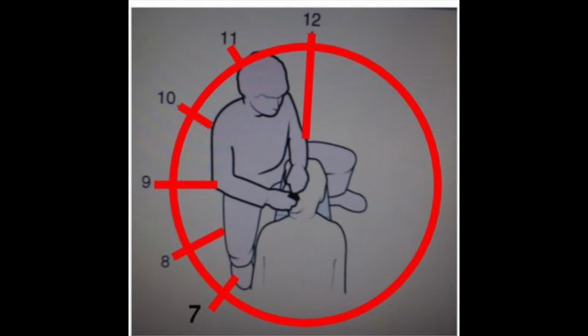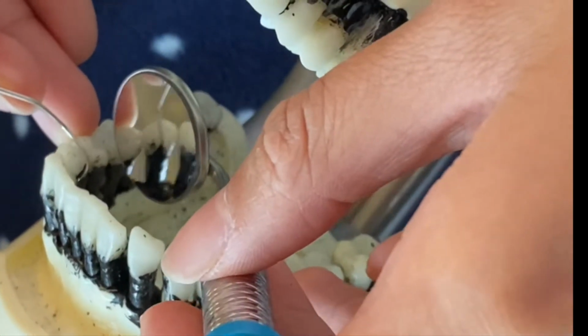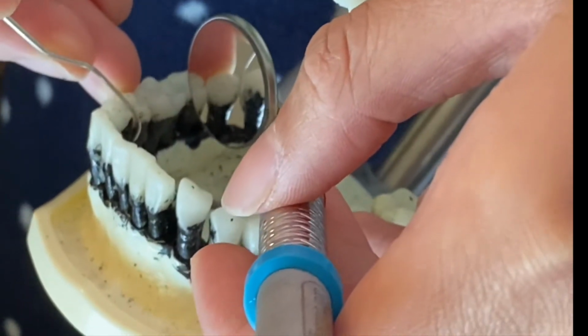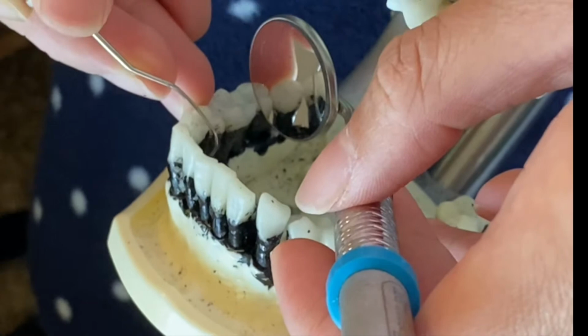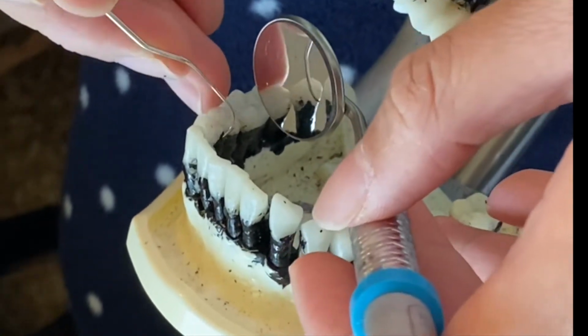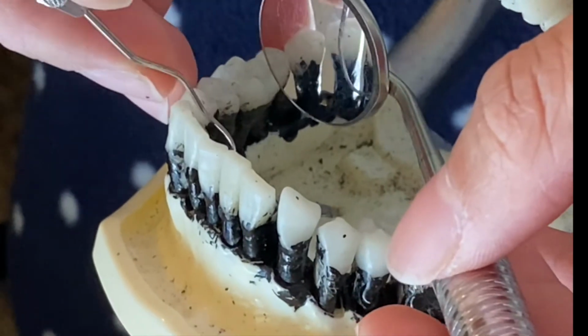Now we'll be doing surfaces away, and I'll have my patient just face forward still, and I will be sitting at 12 o'clock. Here I'll be starting on 27, and I'll be starting at that midline going towards the mesial surface. Then when we get back to tooth 24, you'll be going from the midline to the distal surface. Then you'll make your way back to tooth 22.